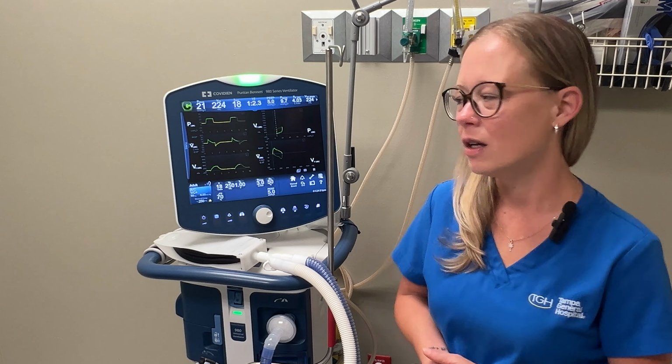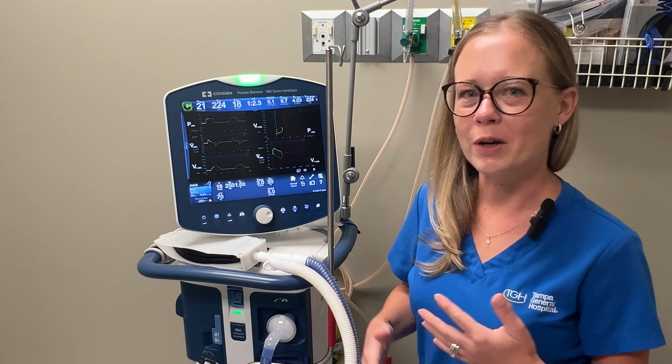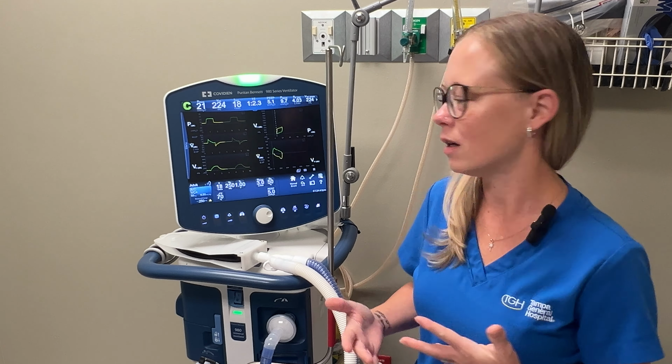This is the Puritan Bennett 980. This is the ventilator we use at this hospital. This is the main screen that you're going to see when you walk into a vented patient's room, and I want to go over what some of these things mean.